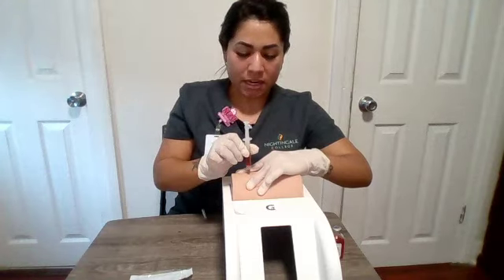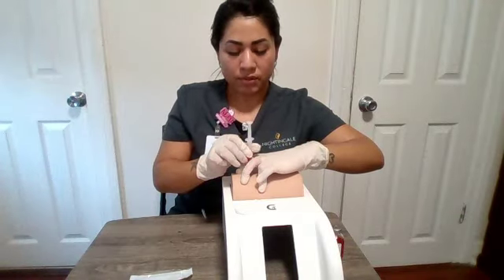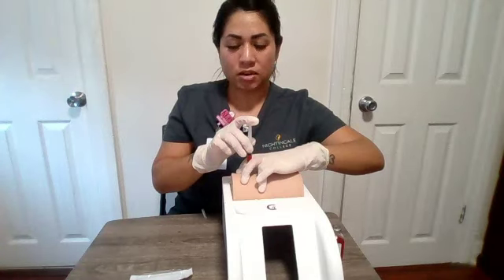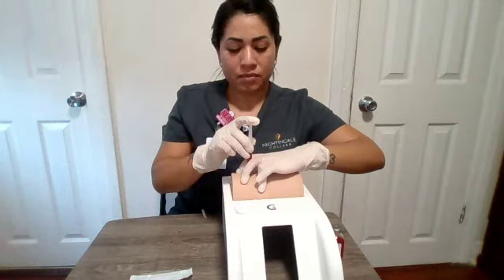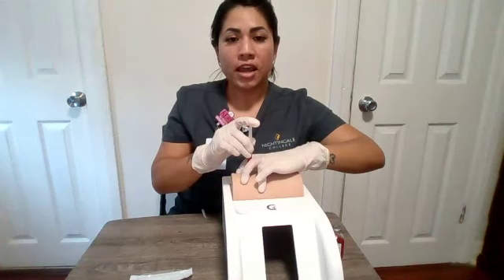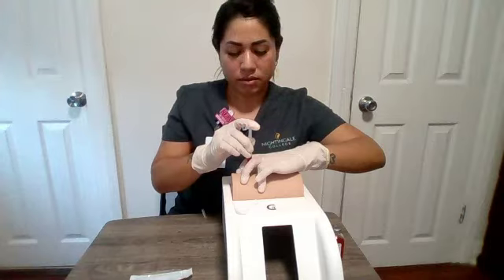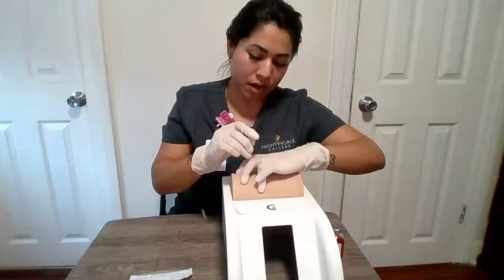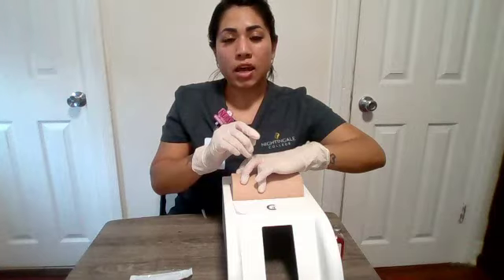Then with my non-dominant hand, I will hold the barrel of the syringe, and try not to move the syringe inside of my patient. And with my dominant hand, I will push on my plunger, and I will make sure that I have stabilized the syringe, and I will inject the medication at a rate of 10 seconds per ml. And then once we have administered the medication, we're going to wait for 10 seconds before withdrawing the needle.